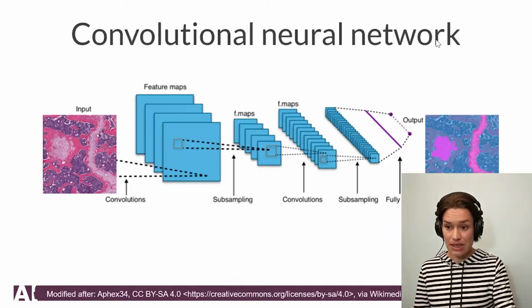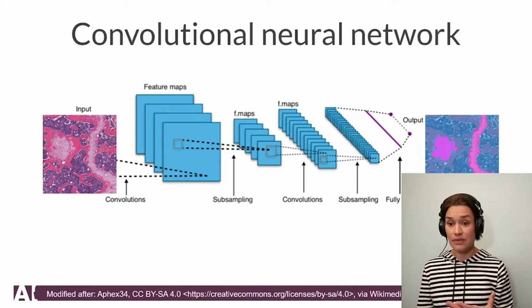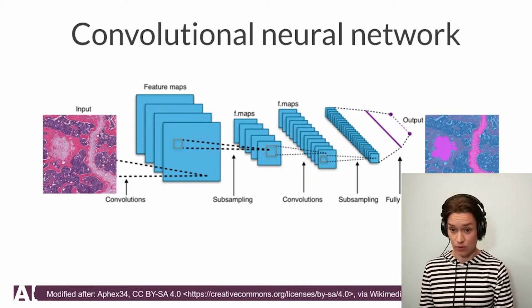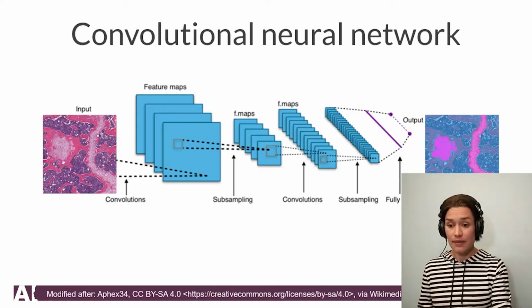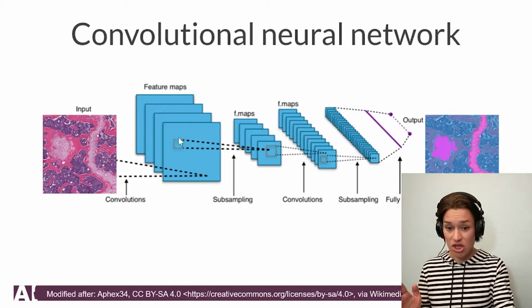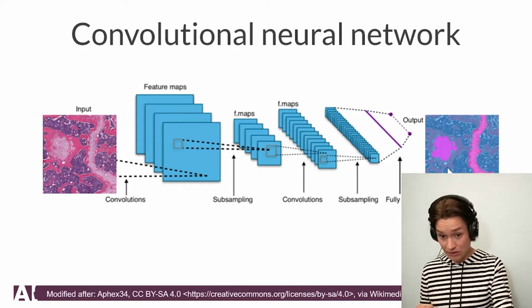And we saw many architectures. One of the architectures that has outperformed other architectures in image processing, in computer vision, is a convolutional neural network. This convolutional neural network also has the architecture that I just showed. But there are two things happening in this network that bring us from the left, the input, the native image, to the right, which is the mask. In this case, the pink is our cartilage and the blue is the rest, non-cartilage.